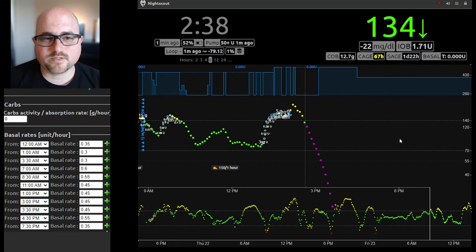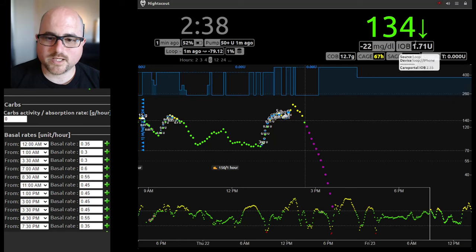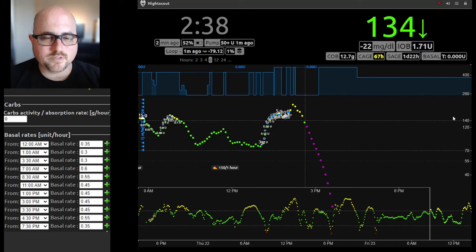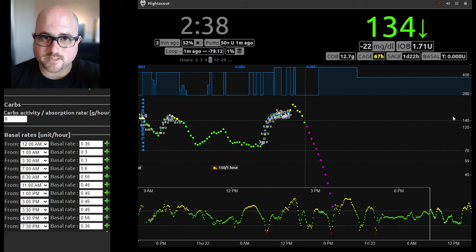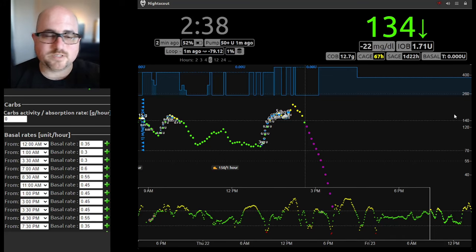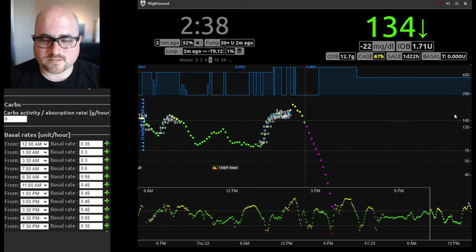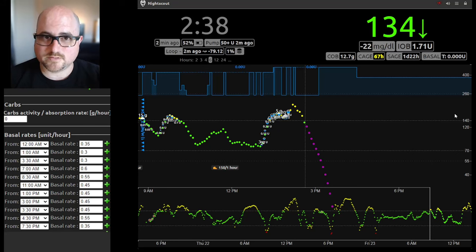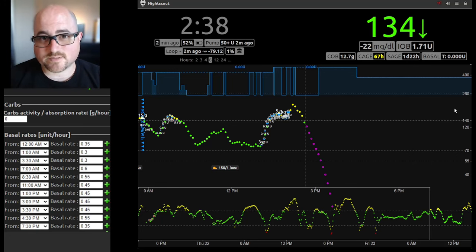First steps first: we're going to look at basal. Basal is always important. We'll be checking it based on the insulin on board. What we're looking for — insulin on board means insulin above and beyond whatever you've told Loop as your basal rate. Basal is kind of considered free insulin to a degree, so insulin on board is anything above and beyond that. If we see positive IOB, we should see a drop in blood sugar, unless there's food involved. And if there's negative insulin on board, we should see somewhere near that a rise in blood sugar. If that kind of stuff's not happening, then basal is not right.